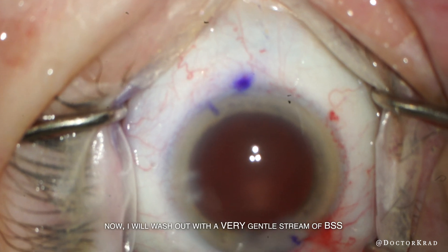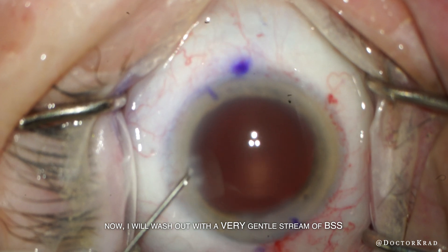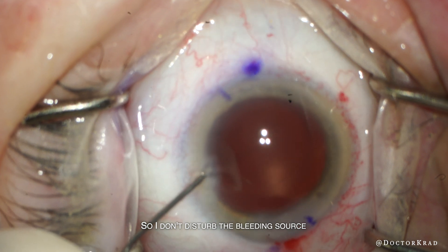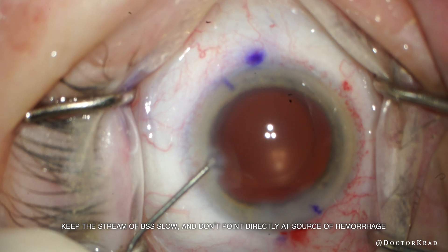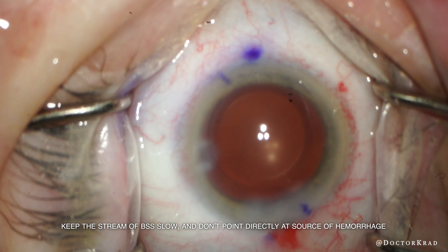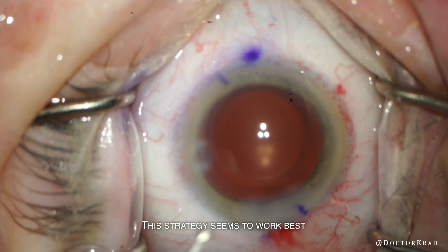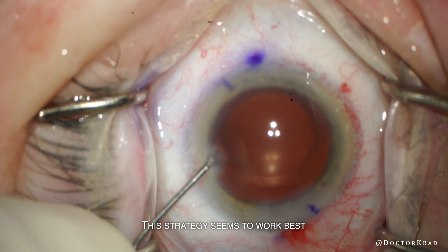Now that I've waited a little bit, I'm hoping that the source of the bleeding has coagulated. I'm going to irrigate the anterior chamber with a very gentle, non-turbulent flow of BSS and I'm not going to point it directly at the area where the bleeding started. I make sure the flow is extremely gentle, hoping to clear out the AC as much as possible so that I don't leave behind a big hyphema on day one. The anterior chamber is getting clearer and I'm not seeing more heme coming from the source on the top right of the screen.